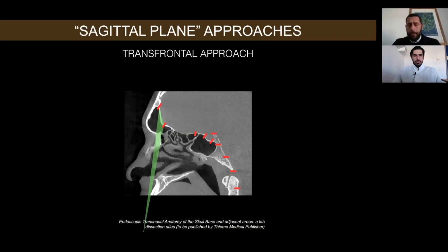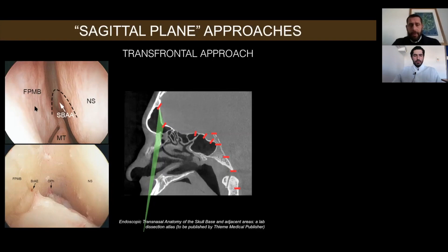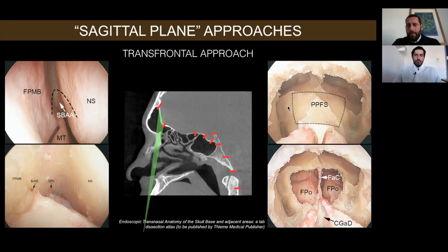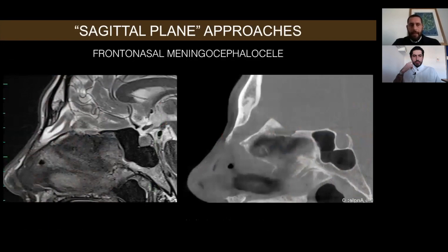The first approach described in the literature is the transfrontal approach, which allows us to reach the posterior plate of the frontal sinus looking at the nasal vault. Our landmarks are the septal branch of the anterior ethmoid artery and the first olfactory filia. We perform a Draf III procedure to expose the posterior wall of the frontal sinus, and after that, if needed, we can open the dura and expose the intracranial structures.